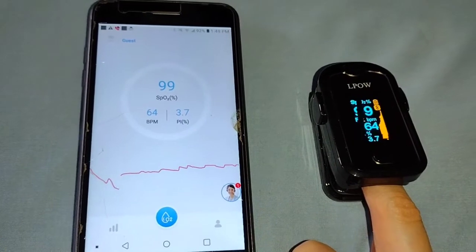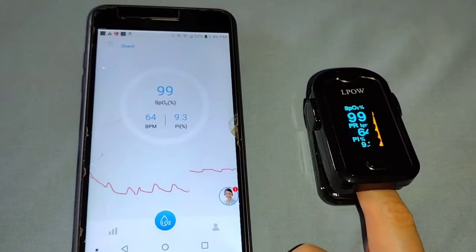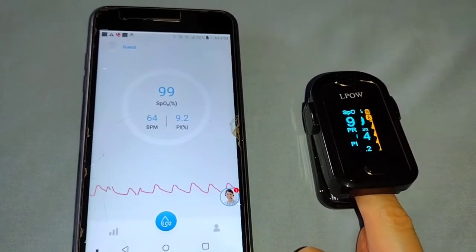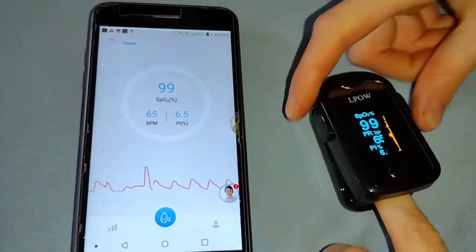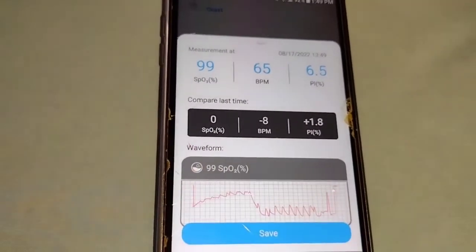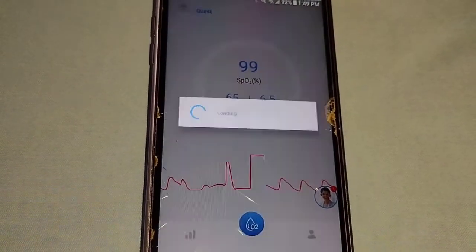Eight seconds later, as you look at both the oximeter and the phone, you'll see they have the same measurement because they are both connected via Bluetooth and the information from your oximeter is being sent to your phone. All you have to do is hit save and the information is stored in the cloud.